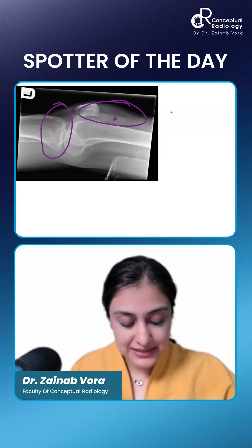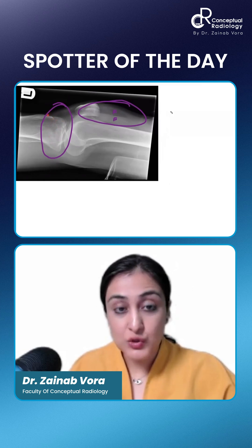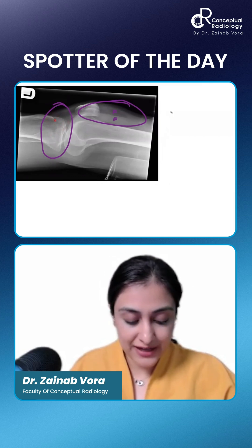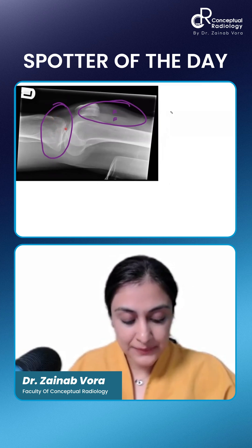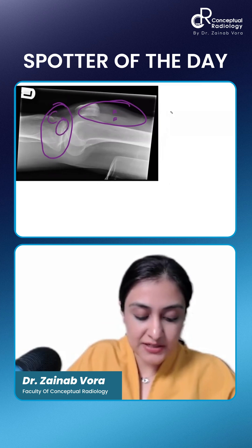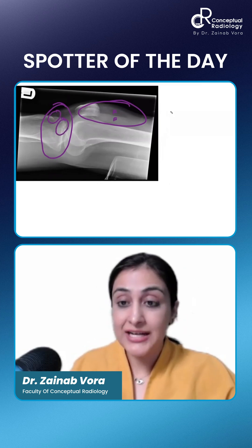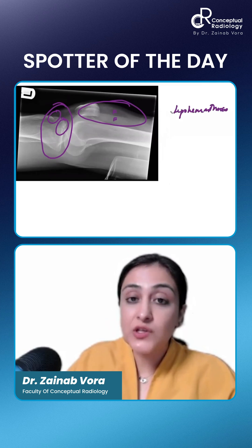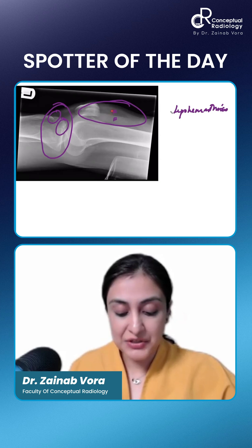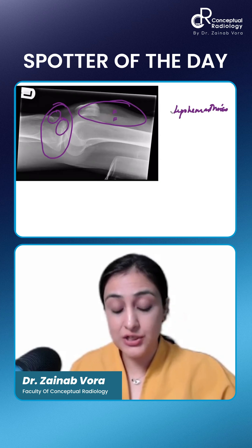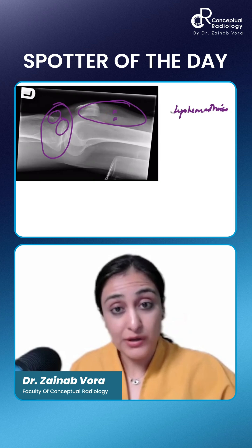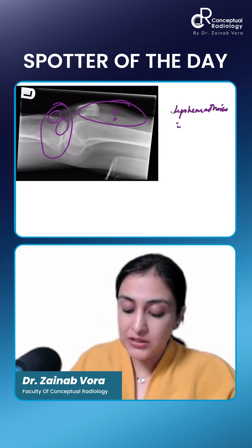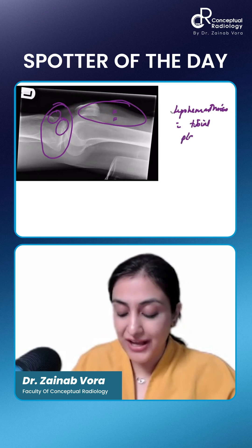You can see that there is a break here, there is a cortical breach, so there is an undisplaced tibial plateau fracture. You can in fact see the fracture line going like this — there is a defect seen here and a discontinuity seen here as well. Always look out in the suprapatellar fossa; you'll see the fat-fluid level more clearly there than infrapatellar, as fat being lighter will come up.